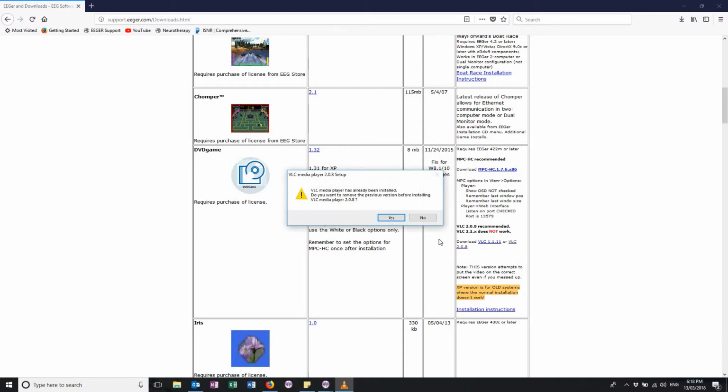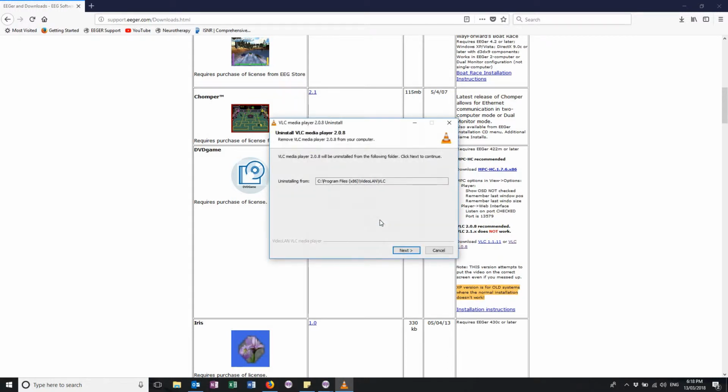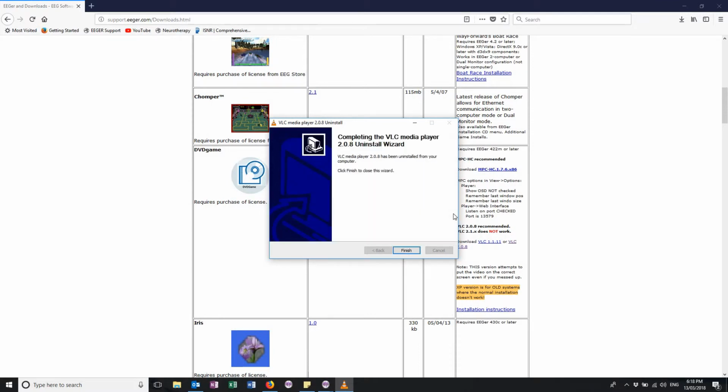So we allow for that app to run, and it'll probably say that VLC Media Player has already been installed, and do we want to remove the previous version? Yes, we do. So click Next. You may have some preferences and a cache in there, so if you want to delete that, then you tick this box, but if you want to keep it there, you untick it, and you click on Install.